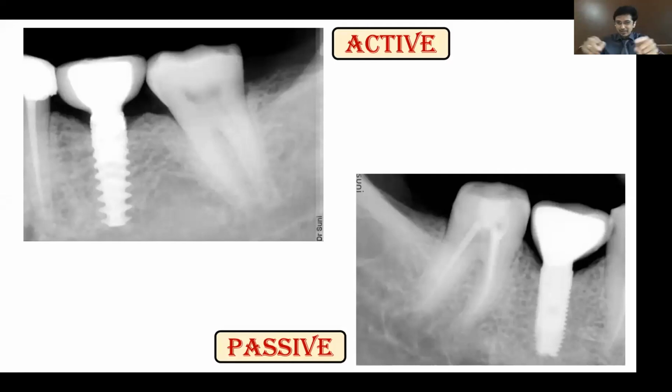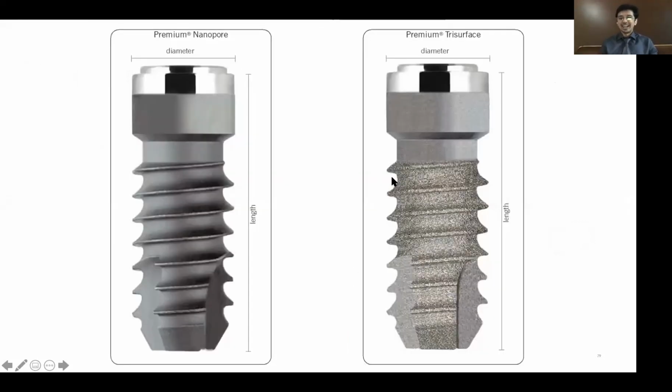Active was deeper threads and passive were threads which were not so deep. Is it fine? I can't see a single hand. In the chat or something, can you say something? Is any attendant here as such, Dr. Shyam? Sir, we got two texts in this chat. Yes, sir. Yes, sir. Yes, please repeat Okay, once. please repeat once. Okay, okay, Understood, fine. So, sir. Like that. understood, sir.